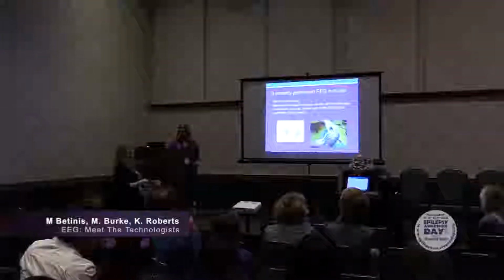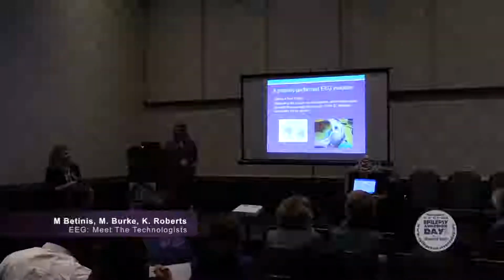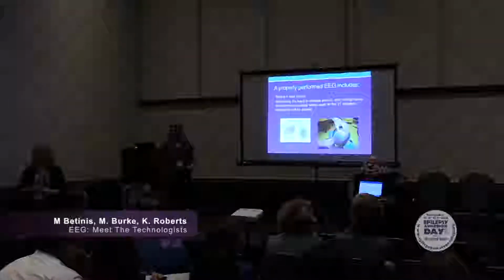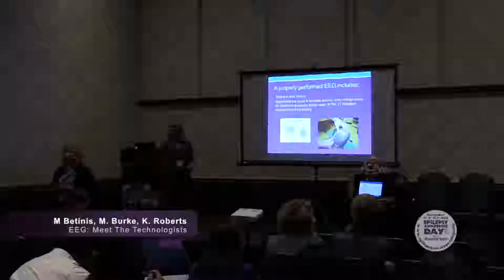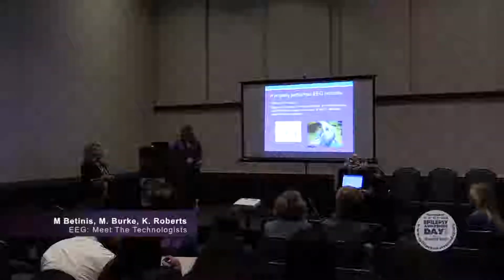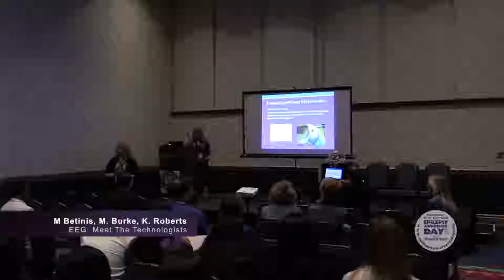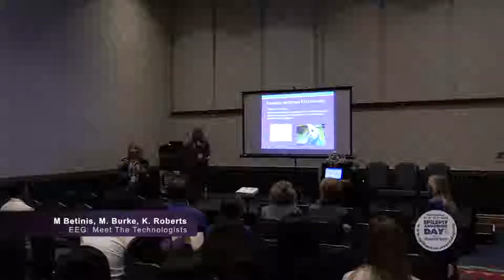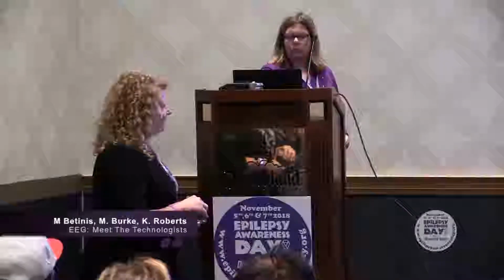And just some of the things to think about, you as a patient or you as a loved one going in and having a procedure done. The role of a technologist is pretty important, and I would advise everyone to be an advocate and ask questions. Technologists need to make sure that they know why you're here, what medications you're on, what it is that is important for us to know, because we're only capturing a short period of time when you come in for a routine EEG. So it's taking a history.